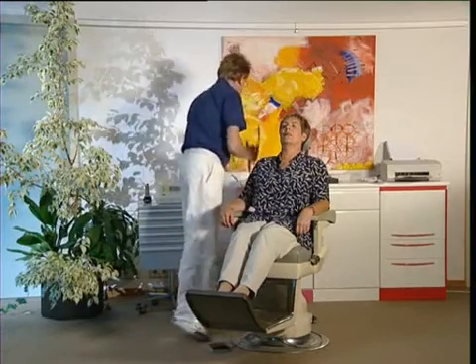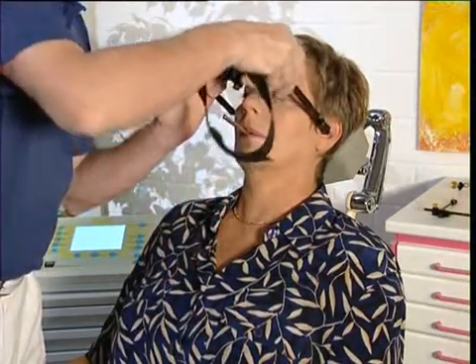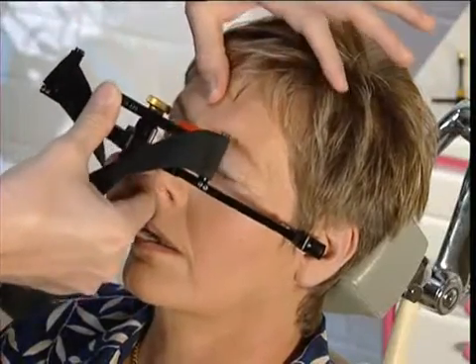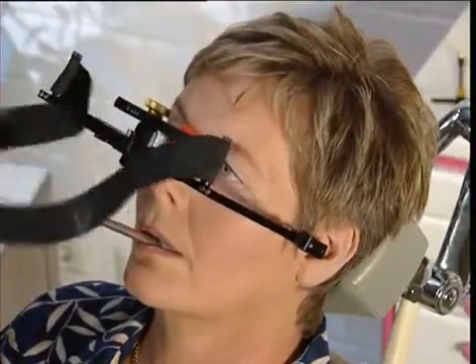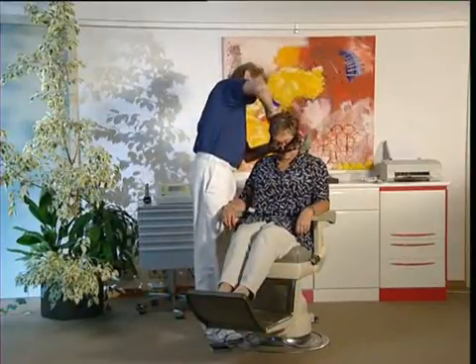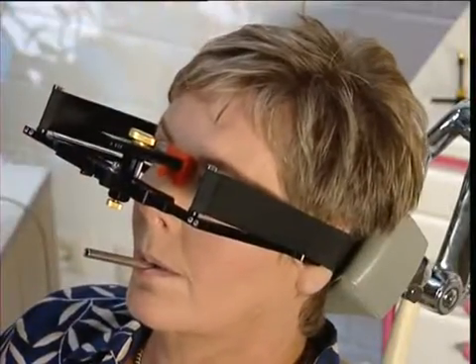The ear adapters of the parallel adjustable reference face bow are inserted into the auditory meatuses without exerting pressure, and the bow is tightened at the front with a set screw. The nose piece is then placed on the glabella carefully and also tightened. The neck strap is tightened across the back of the head with a Velcro to hold the face bow in place and prevent the ear adapters exerting pressure on the condyles.